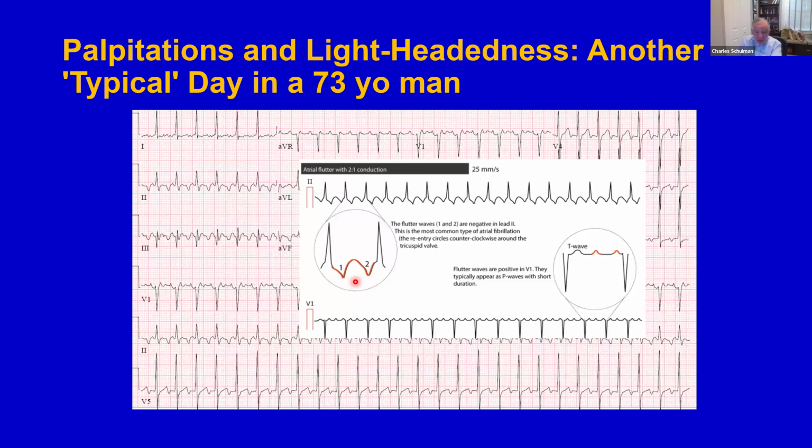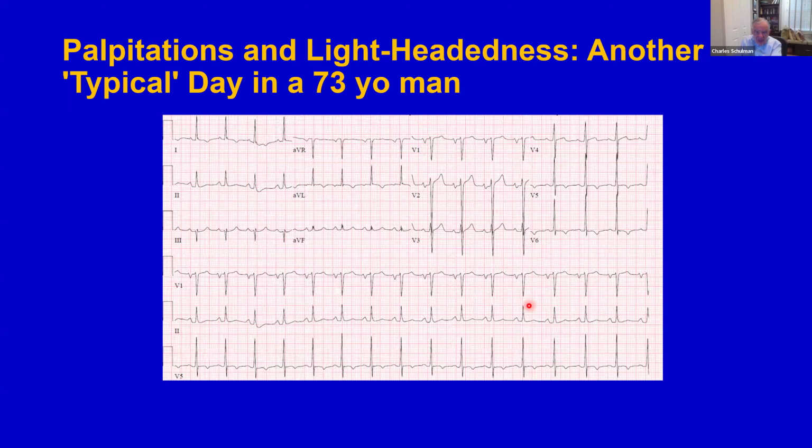And this illustrates where they are. Okay, and here he is back in sinus rhythm. And you can see that this is sinus rhythm with sinus P waves.